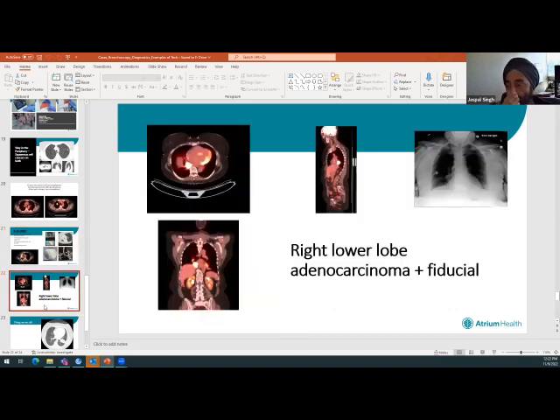And just yesterday, I had a case where this patient, I don't know if you can appreciate it, looks big, like a big lesion. You're like, Singh, why can't anyone get that? Well, if you think about it very carefully, I'm going to orient you a little bit. This patient had prior lung cancer and was deemed to be cured. It came back a couple of years later, and then it came back, and then we treated again. And now the question is, is this a recurrence or a new cancer?